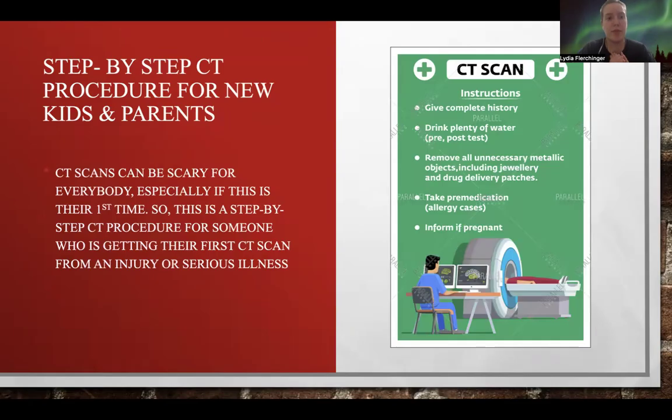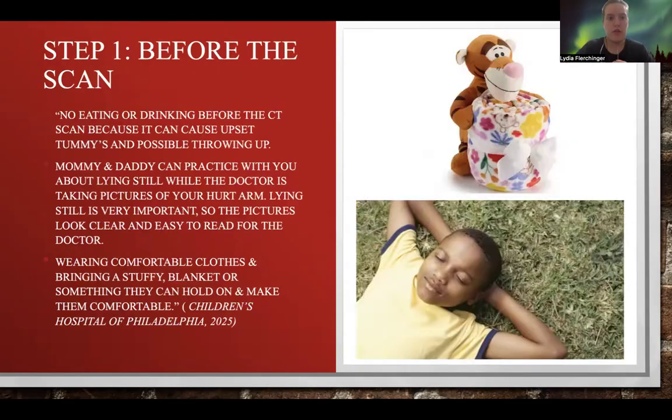So we're going to do a step-by-step procedure for new kids or parents that have an ouchie or an illness in their body. So step one, before your scan, make sure we don't eat or drink any food or liquids before our CT scan, because it can cause our tummy to be upset and cause throw up, and we don't want any of that.